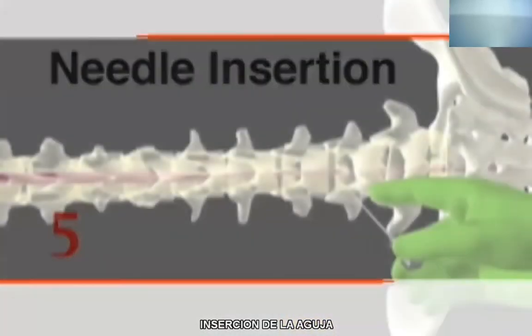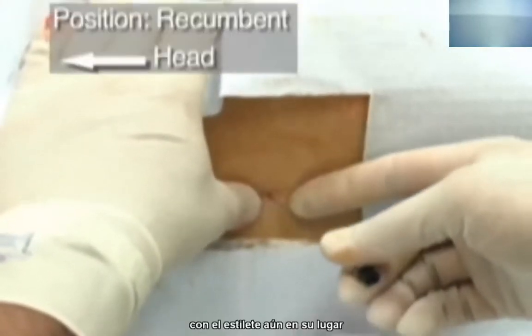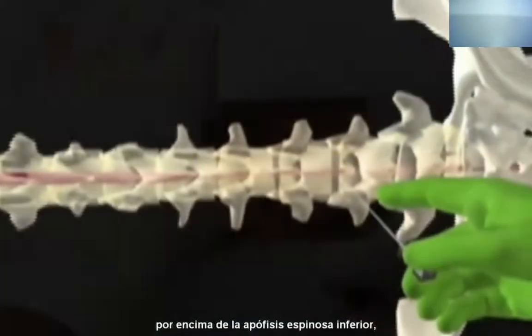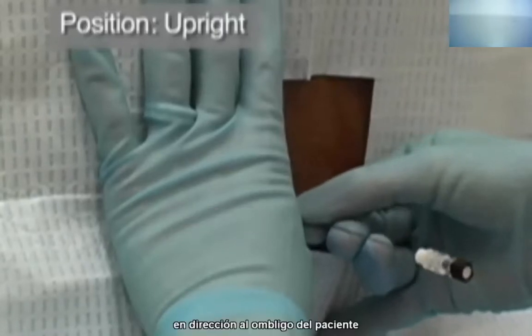Identify the anatomical landmarks once again, and insert the needle with stylet firmly in place in the midline at the superior aspect of the inferior spinous process, directing it at an angle of approximately 15 degrees, as if aiming at the patient's umbilicus.